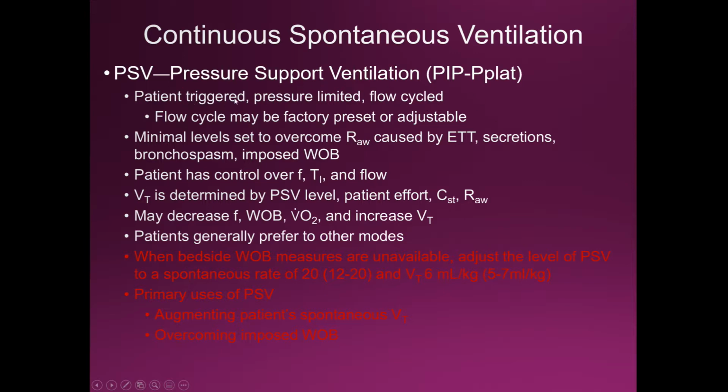So again, patient triggered, patient starts the breath, pressure limited. There is a control. We're setting the pressure, so it's limited to what we set, and flow cycle, meaning to say if the flow stops, it's going to end the inspiratory phase of the cycle.